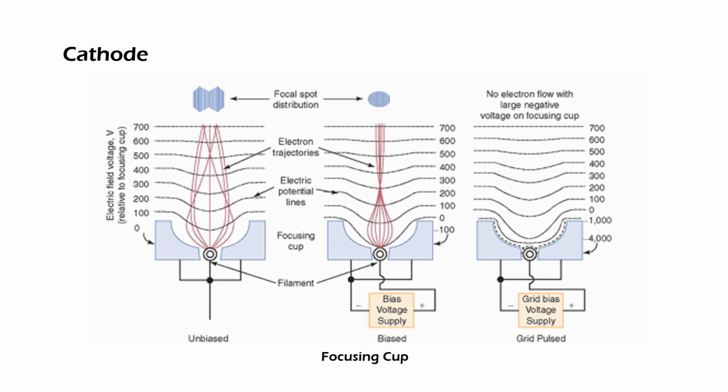The focal spot dimensions are determined by the length of the filament in one direction and the width of the electron distribution in the perpendicular direction. The large focal spot is used with an area large enough to permit a sufficiently large tube current and short exposure time. For magnification studies, a small focal spot is necessary to limit geometric blurring and achieve adequate spatial resolution. We will cover more on focal spot later when we discuss the anode.